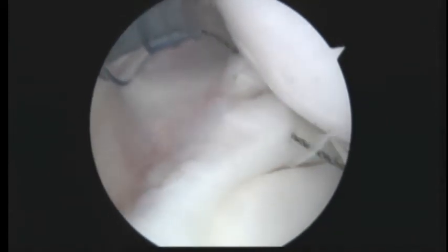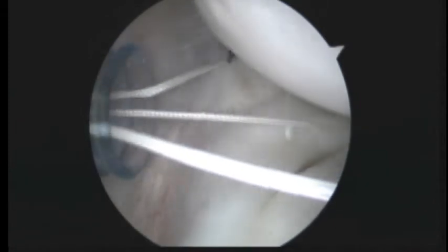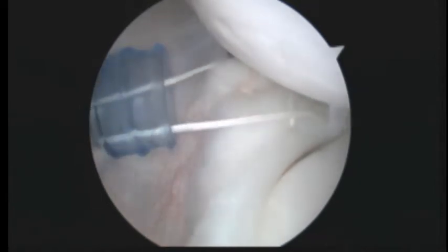Okay, we'll show you some more in just a minute. Okay, so now we've passed that one stitch twice, and we're getting the partner suture here. We're going to go ahead and tie a knot here. You can see how that creates kind of an 8 or a cross, which is why it's got that name.